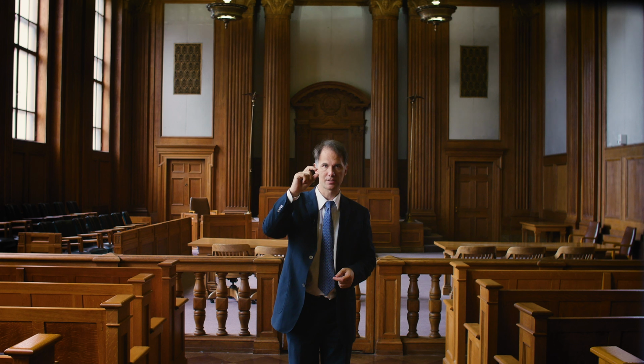I've had a number of cases now where with the 5 millimeter slices at standard resolution, you won't see very much of anything. And in fact, some of the radiologists will think that it's what's called small vessel disease. In other words, sort of plaquing in your blood vessels in your brain. And they'll think it's just a minimal issue, everybody's got it, no big deal, and they'll read the MRI as normal. But when you go to the 3T machine and you take the 1 millimeter slices, you can see that what the other radiology facility saw was only the tip of the iceberg. And if you've ever seen one of those illustrations, you know that the iceberg really only sits on top and the vast majority of it sits underneath.